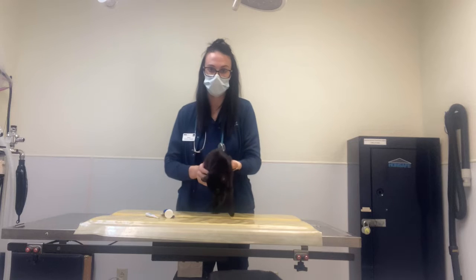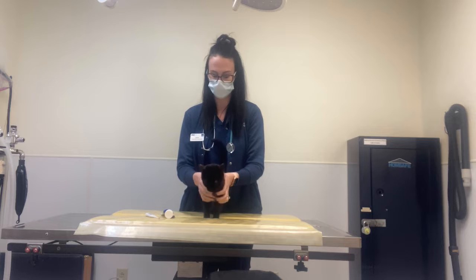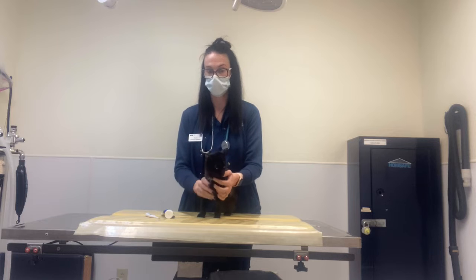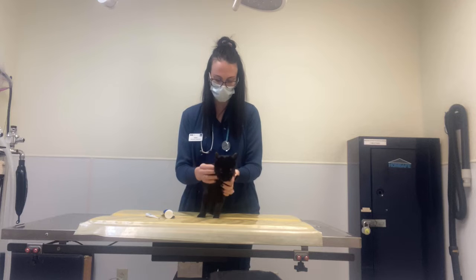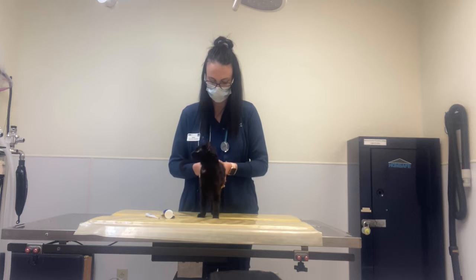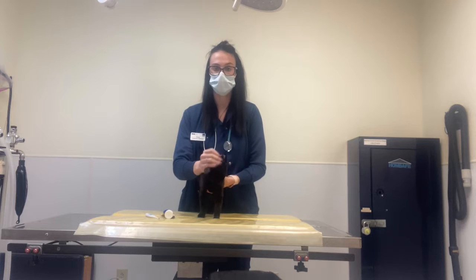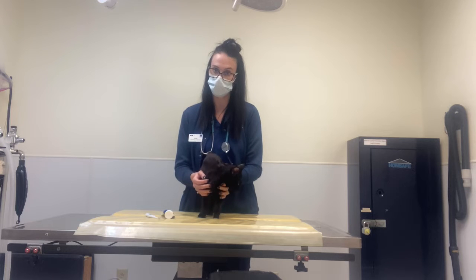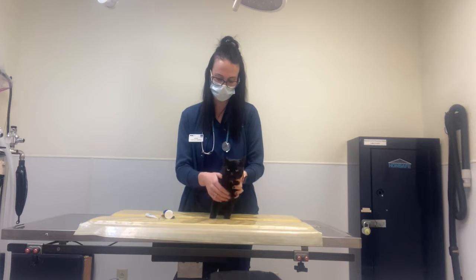Okay, so this is demonstrating how to do TPRs, listen to the heart and lungs, and assign an ASA score. TPRs are temp, pulse, respiration. Of course, you take the temp rectally. For the respirations, you can watch, or you can hold the abdomen lightly and feel it go in and out. Sometimes with cats, not so much, but dogs are either panting or trembling really hard, or they're just sniffing everything in sight, and a respiration is really hard to get.